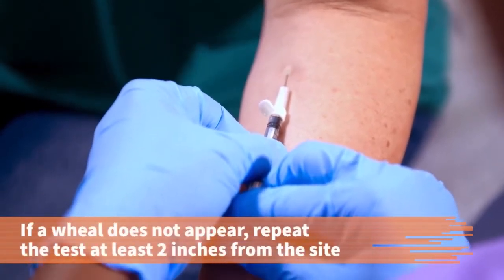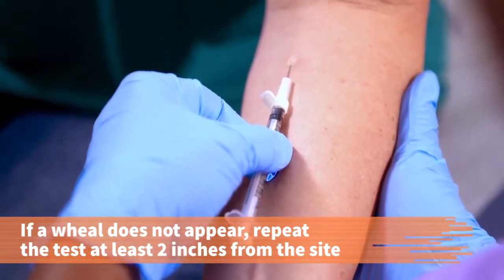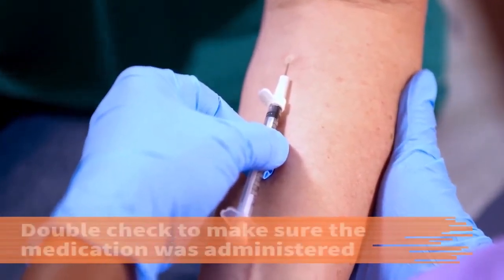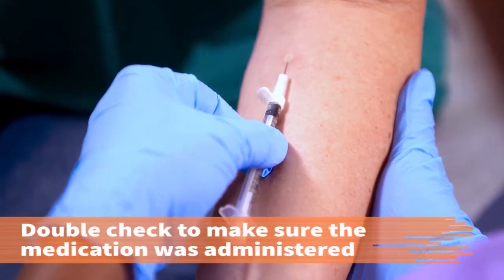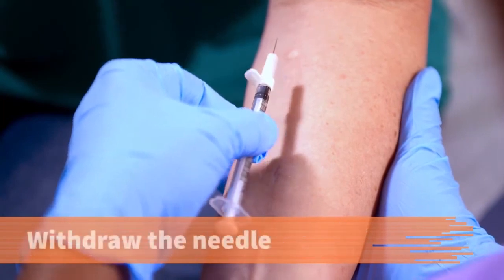If a 6 to 10 millimeter wheal does not appear, repeat the test at least 2 inches from the site. Double-check the barrel of the syringe to make sure all of the medication was administered. Withdraw the needle.